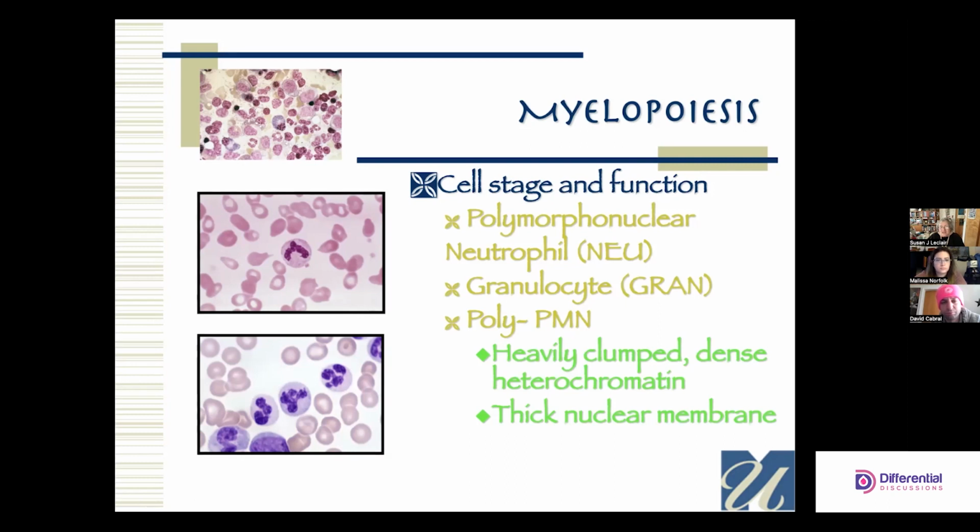So what was it in geometry? If one thing is equal to another, then they're equal to each other, or something like that. That's kind of what you're looking at, is the darkness of these cells, as opposed to the lightness of this one.